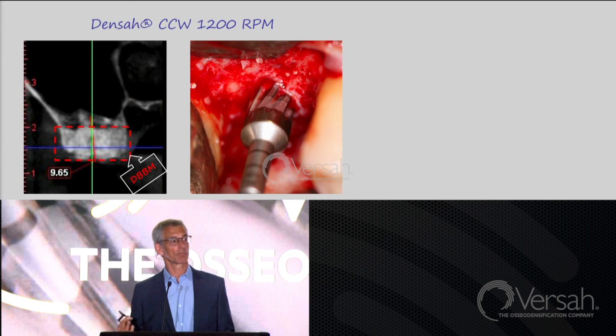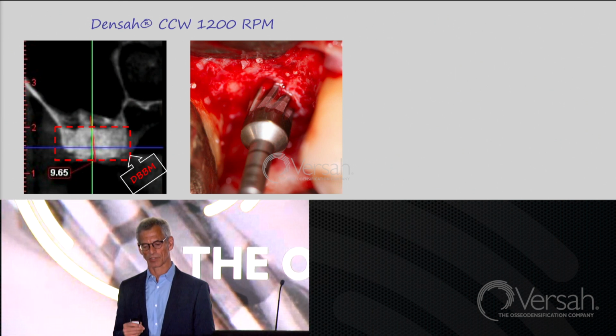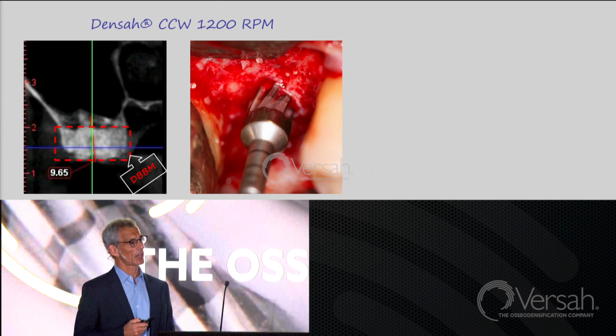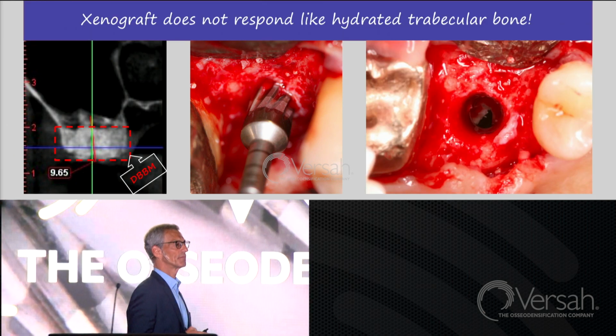And I'm going to use my bone densification because that's what I used in my staged sinus grafts. I'm densifying entirely xenograft. And when I withdraw, what do I see? My first Densar perf.